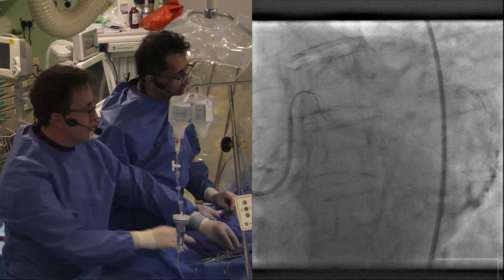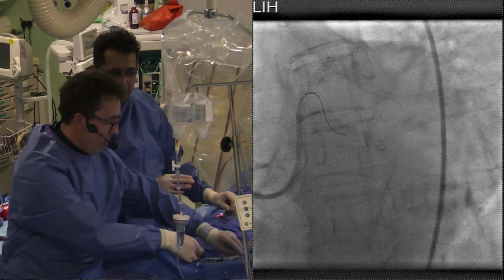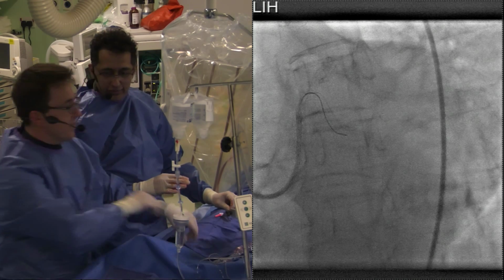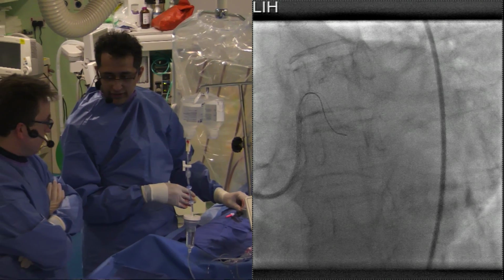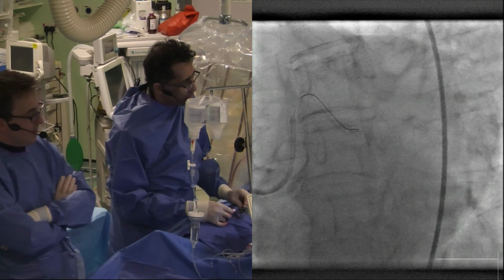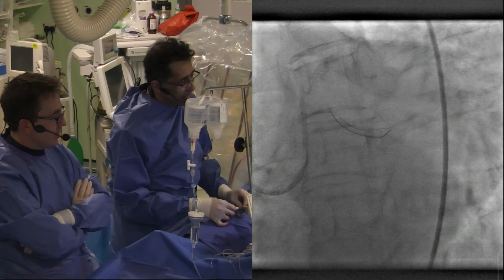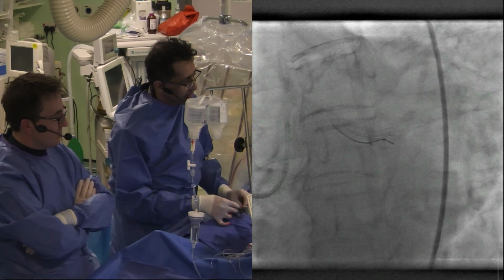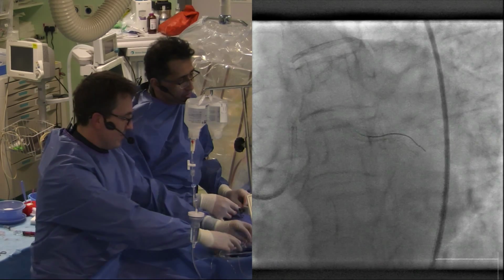Yep. Okay. So you can maybe see that this is behaving like an angioplasty wire. In the pressure wires of old, that very acute bend would have had the guide catheter out, and I think this is really behaving very much like an angioplasty wire would. We can appreciate the stent, and this is really without a great deal of effort. I hope I don't jinx it. Without a great deal of effort, wandering down. And just a little test again, just to make sure I'm in the main branch.